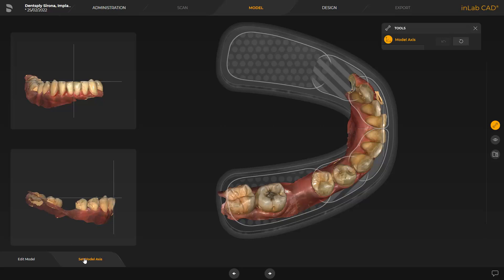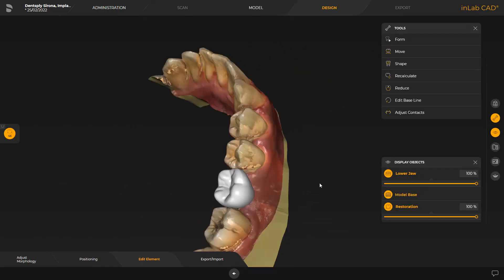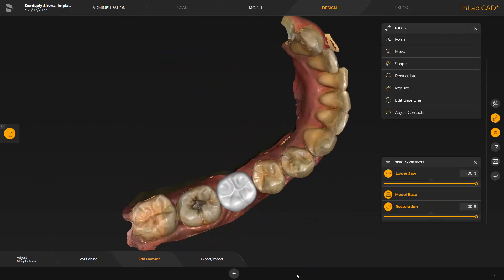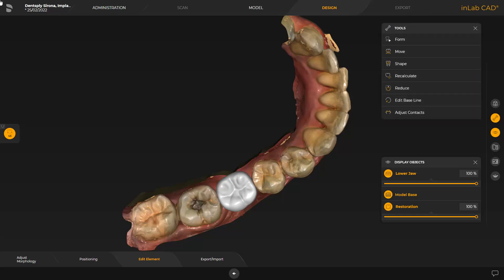Next, we proceed with the design phase. We review the InLab CAD software design proposal, which we can modify with the available tools if needed. Without making any changes, we go to the next step, export-import.